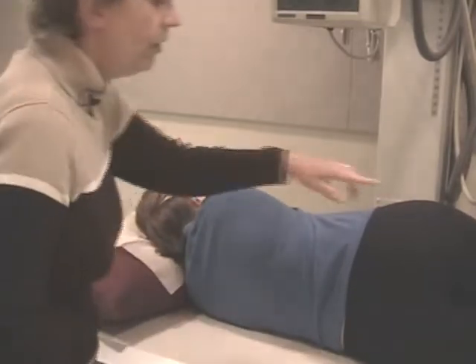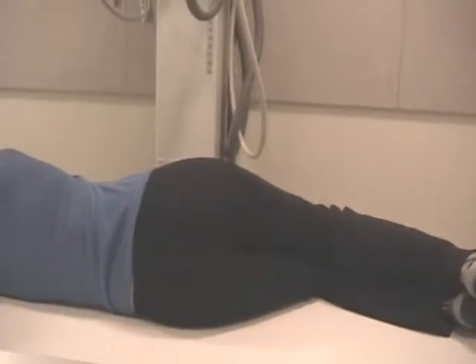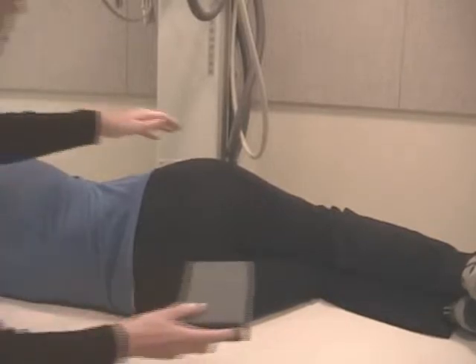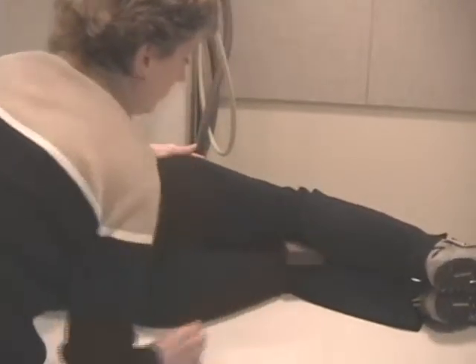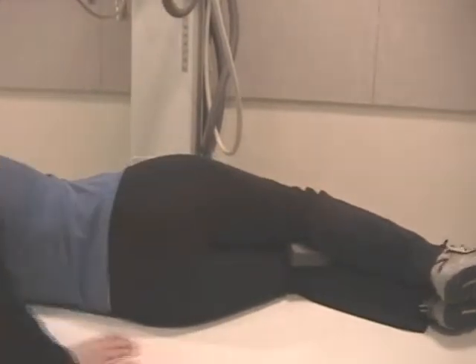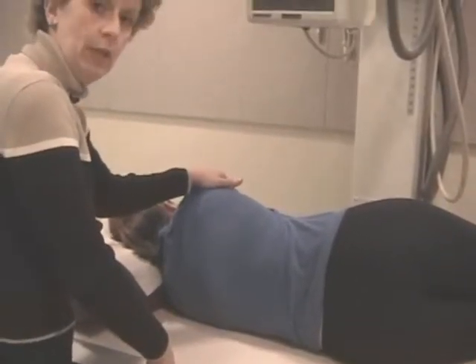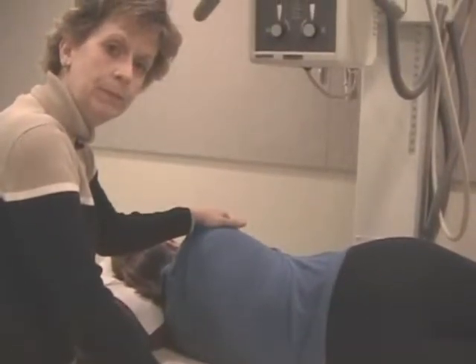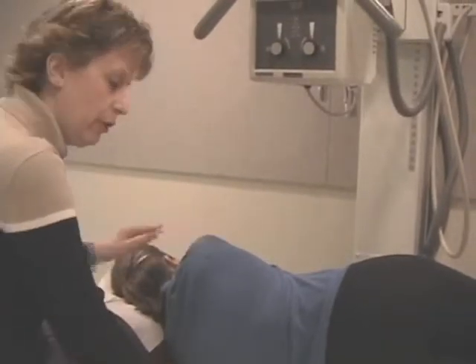Okay. And I want the knees one on top of another. And for comfort, it's a very good idea to put a sponge between the knees. Okay? Knees one right on top of the other, the feet on top of one another, arms in the same position. And I want you to get the patient straight on the table, and I want them in the lateral position. So those are 2 things I'm going to work on right now.